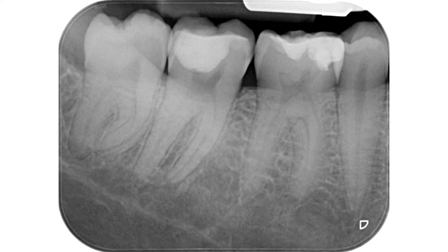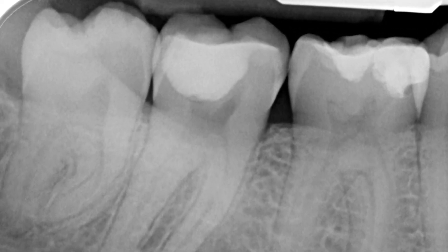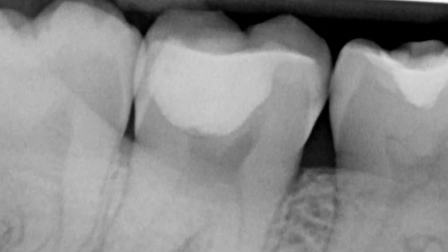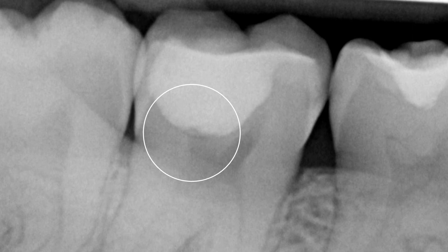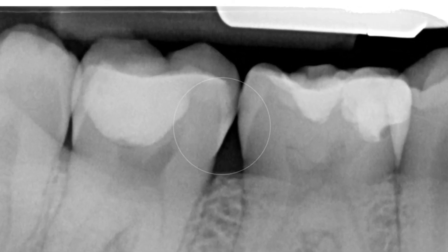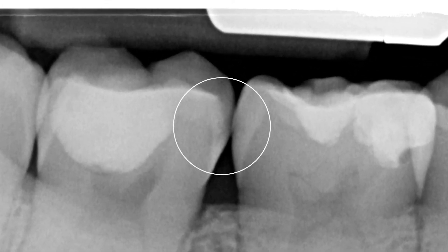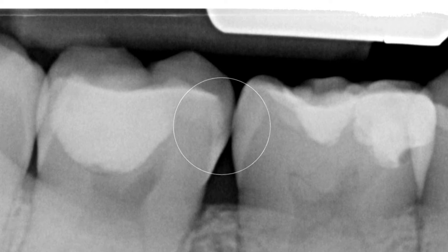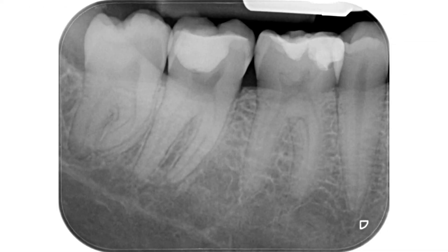The patient was not able to indicate the responsible tooth. A periapical radiograph shows that the mandibular second molar has a deep occlusal composite restoration adjacent to the distal pulp horn and an interproximal mesial caries lesion. The cold test gives a severe painful response for this tooth, lasting several seconds after removal of the stimulus.